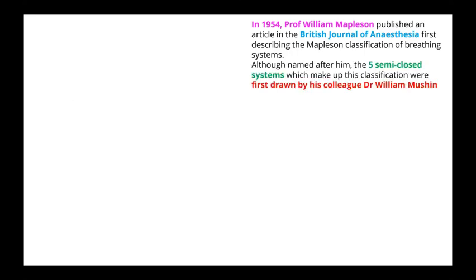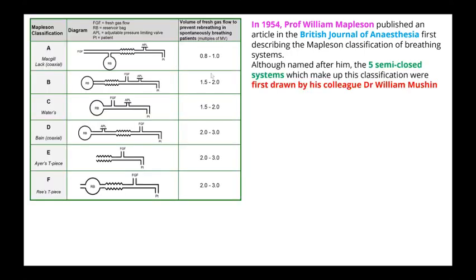And this is some history of this. Sometimes they ask to selectively describe the Mapleson circuit or the breathing systems and their functional analysis. That is how the question may be worded also. So this Magill's A or Mapleson A system, the Magill system, you can see the fresh gas flow is coming from the machine. The reservoir bag is close to the machine. Then there is a corrugated rubber tubing, then there is an APL valve, then this goes to the patient. So the apparatus dead space will end here. This is the portion of apparatus dead space, and it requires almost a minute ventilation.